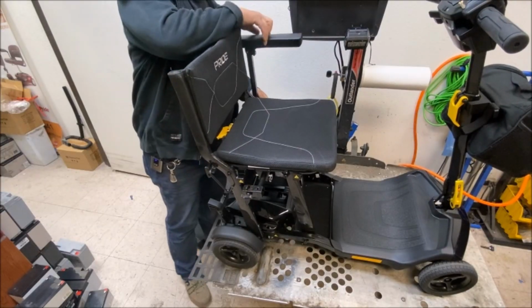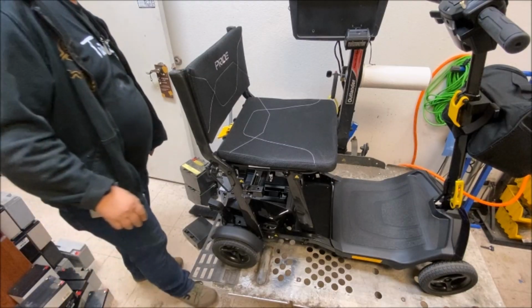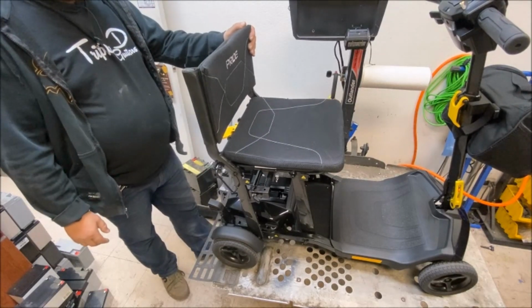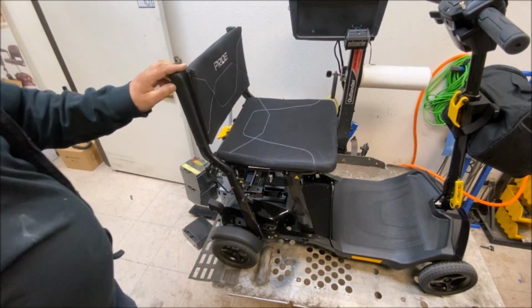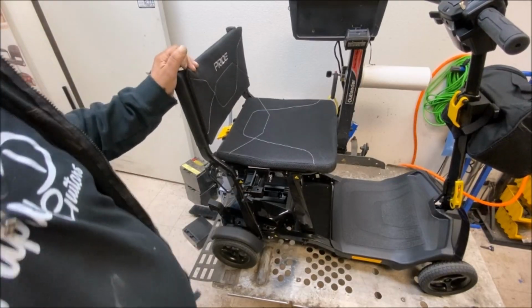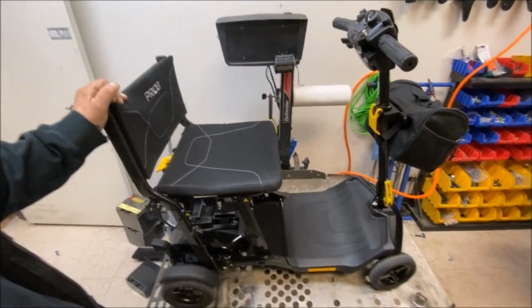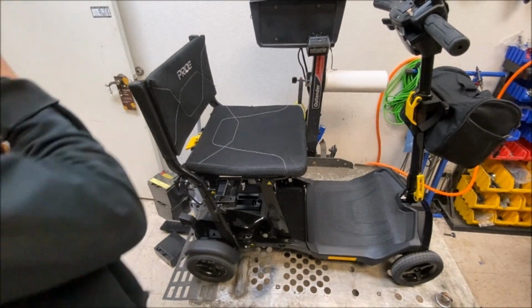I haven't done many videos lately because I've had nothing new to show you, so it's been a bit scarce, a bit quiet this end of the year. I made a few sales, but yeah, not many repairs. There've been a few, but nothing that you haven't already seen, or nothing new. There's one thing I am messing around with at the minute, is this thing here. It's an Ultra X. I had a customer in yesterday, and one of my biggest questions I get asked is, can you make them go faster?